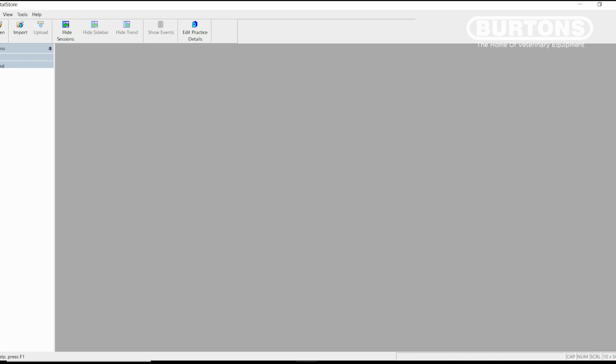So that really concludes the quick overview, or relatively quick overview, of the VitalStore software. There are some features that I haven't covered, but if there's something specific that hasn't been covered in this video and you wish to know more about it, do feel free to contact me at Burtons or any one of the clinical team, and we'll be more than happy to help you.